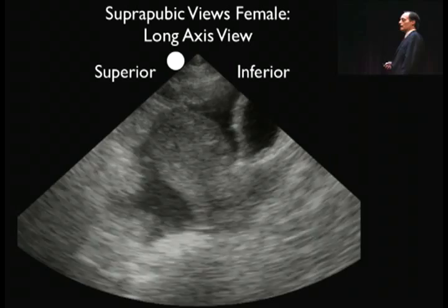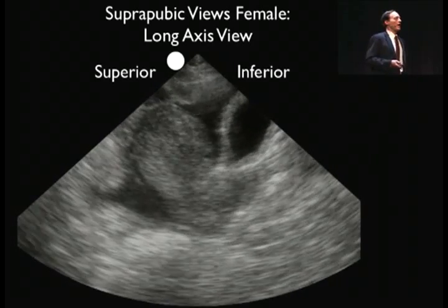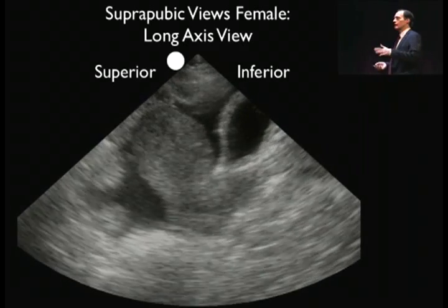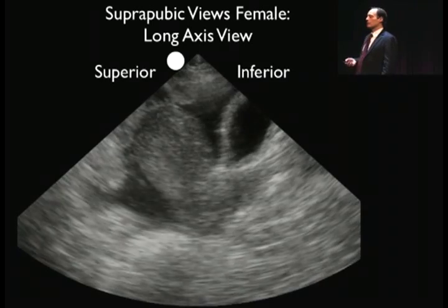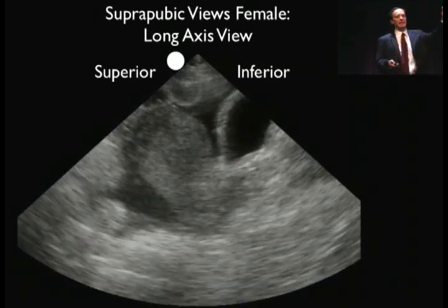Absolutely. Let's take a look at this one. This patient, unfortunately, fell out of a window. And so she came in, and her blood pressure is 90 over palp. So she's kind of in between stability. You put the probe there, positive or negative exam? Positive examination, very much so.